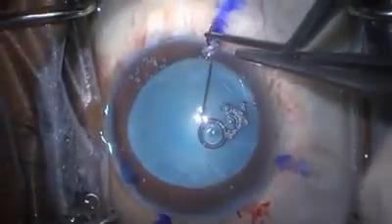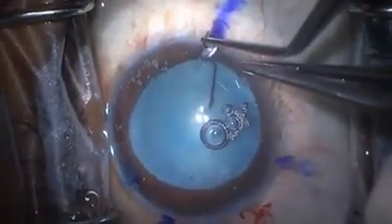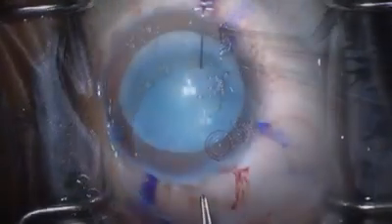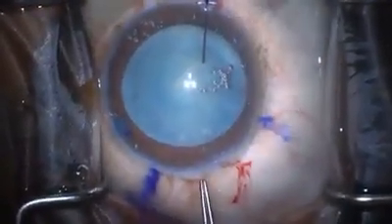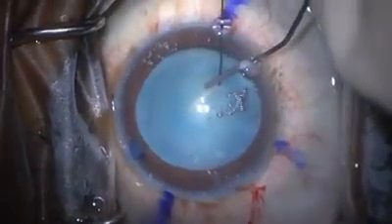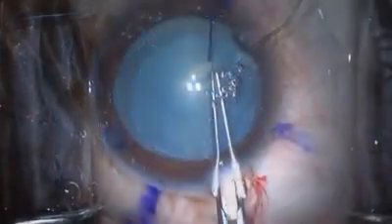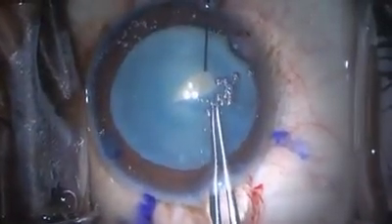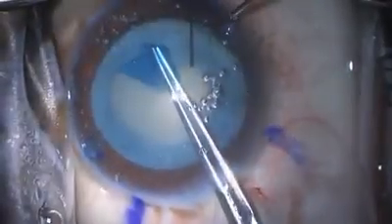And so we use a single iris hook here just to give us some support in the capsule while we're doing the rhexis. And what this does, it just gives us some support to pull against while we're doing the rhexis coming around this corner. We're going to use a little cohesive viscoelastic just to tee ourselves up here. And the rest of the capsular rhexis goes pretty well with this little bit of extra support.